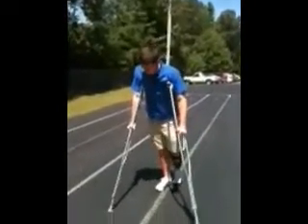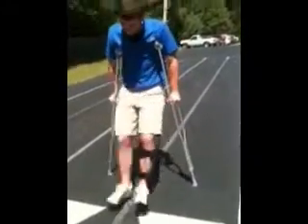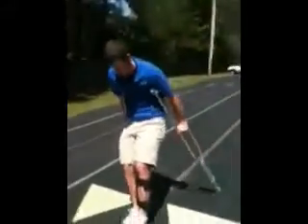Then you're going to put them in front of you, about a foot and a half, two feet in front of you. Then you're going to kind of hop, like this, and then keep going. And you just walk, just like that.